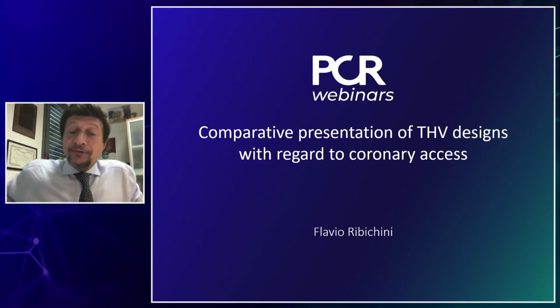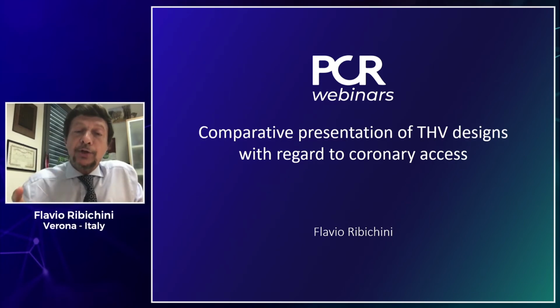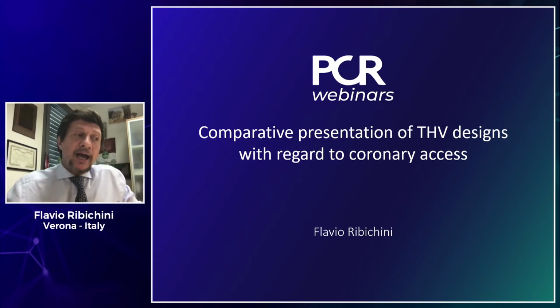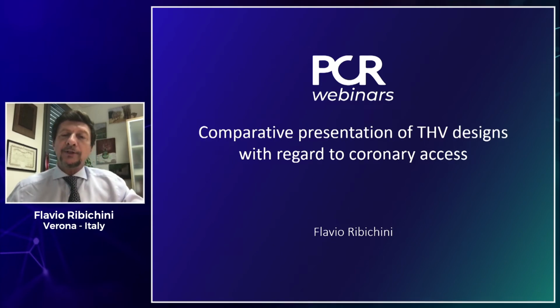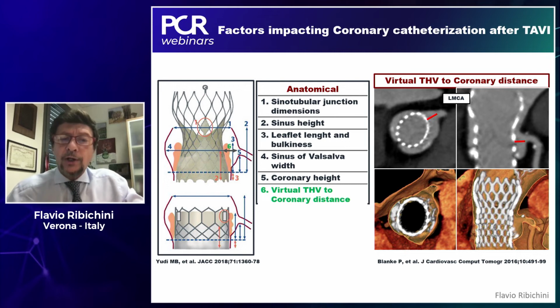Well, you have seen before the orientation of the CoreValve, but each valve has its own recommended technique. So please show the designs. This is very important, that all cardiologists should be confident with the different valve types. On the left, you see a self-expandable supra-annular CoreValve, which is supposed to be the most demanding when you want to get into the coronaries.